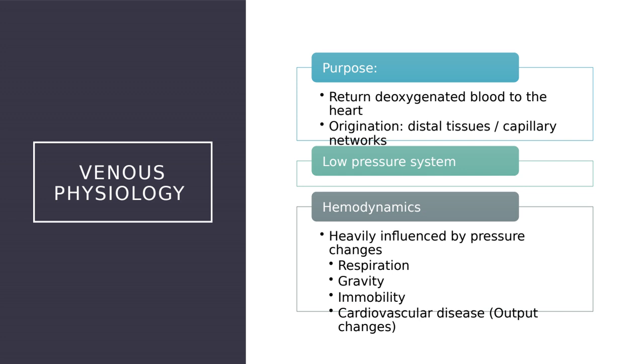Anything in the vascular world. So we're starting off with venous legs, but there's also venous arms that we evaluate. Then there's arterial legs, arterial arms, carotid artery exams, Doppler exams. Anything that is considered a vascular exam is going to be very different than a general exam that we're used to scanning. Protocols are different, techniques are different, we're implementing different things because the cardiovascular system is so functional.